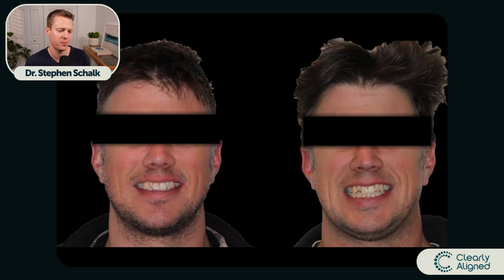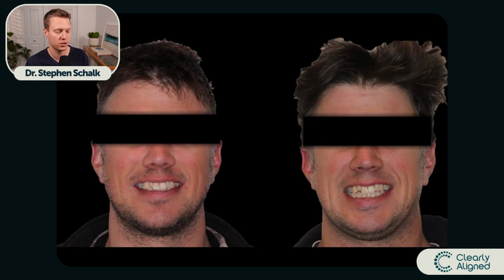And this is why I warn the patient before we start that at the very end, we're going to be lining up the gingival margins if he agrees to it, which he did. But that means that we're going to be building up these teeth to be longer. Because if you didn't know that this is what we were intentionally doing, you would think that I'm terrible at my job. But this is all intentional. We're building the foundation in the right spot to then be able to put the walls back.